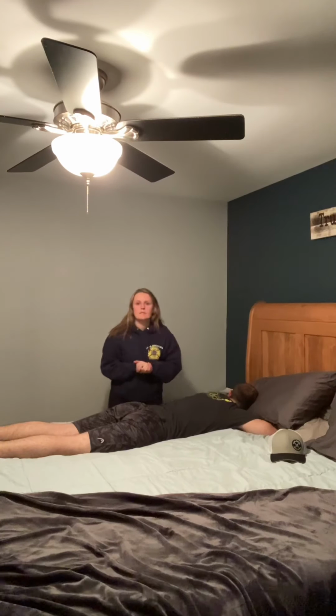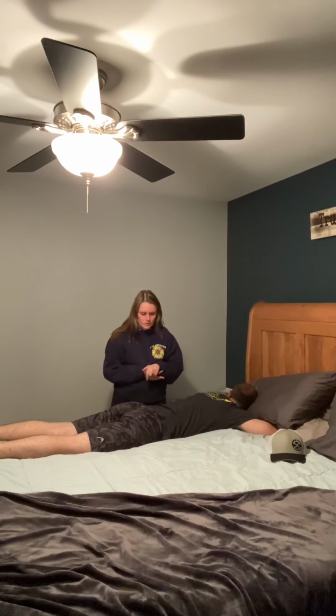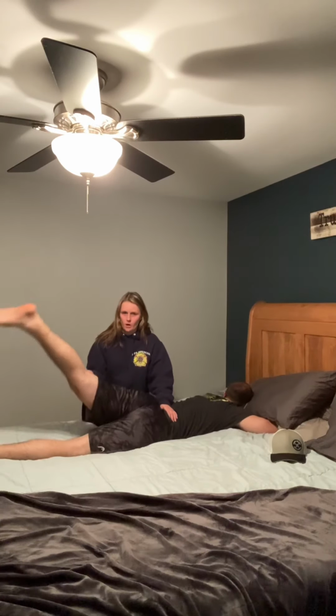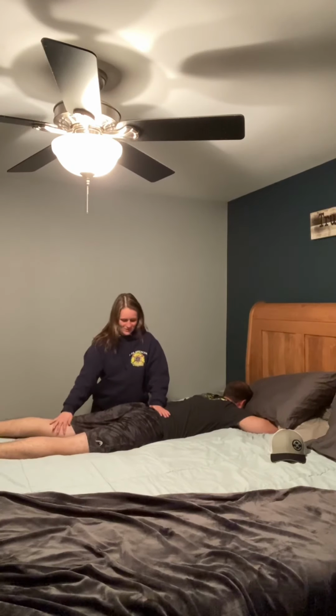Okay, so this test is for hip extension. We're gonna do the combination test first. So you'll have your patient in prone on the table. You are going to stabilize the pelvis and you're gonna ask the patient to lift their legs straight up off the table without tipping. Good, come back down, just straight up.